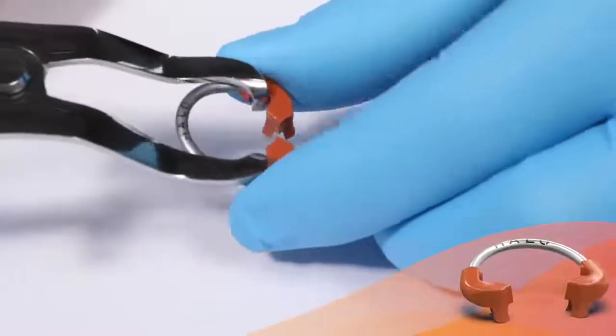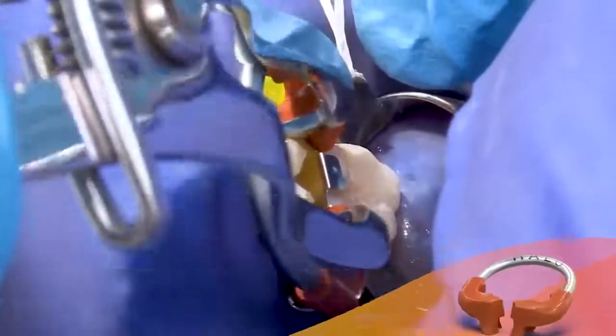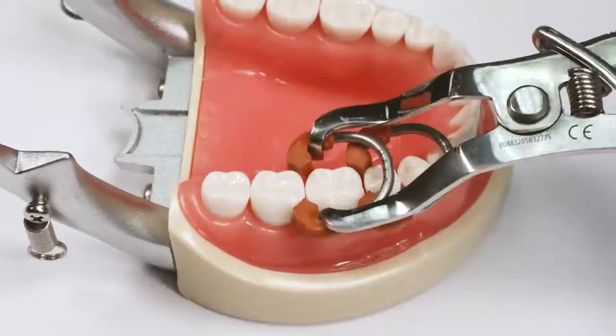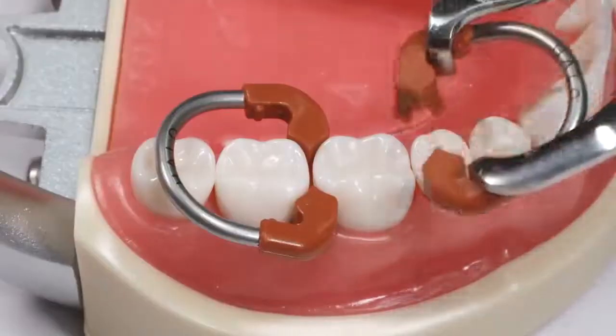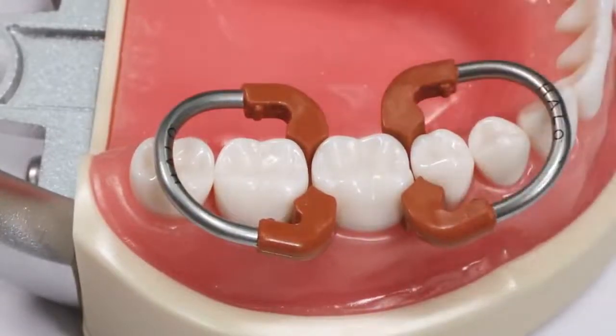Carefully place the Halo ring using forceps. The ring should be placed as low as possible with the tine ends of the ring straddling the wedge on each side of the tooth. Rings can be stacked or configured with one ring toward the distal when performing multiple restorations.